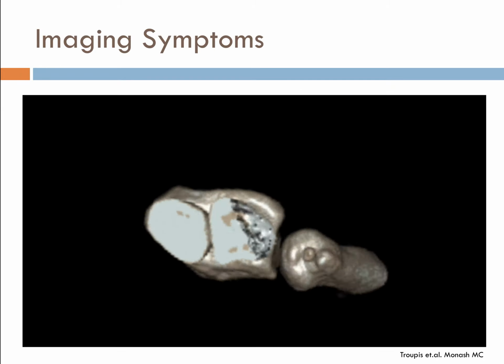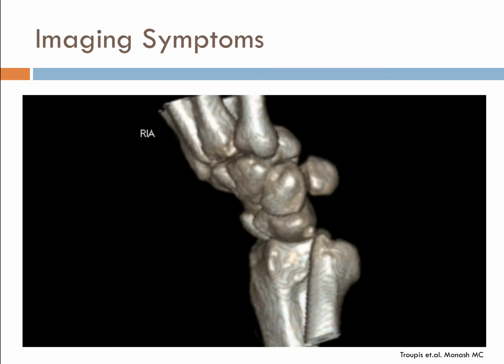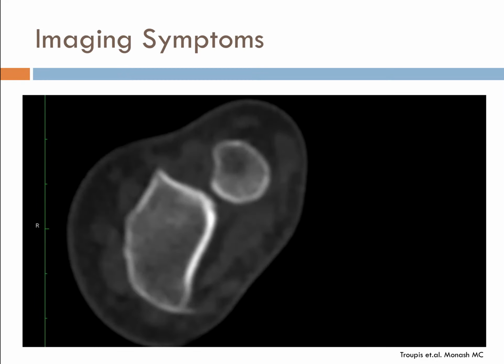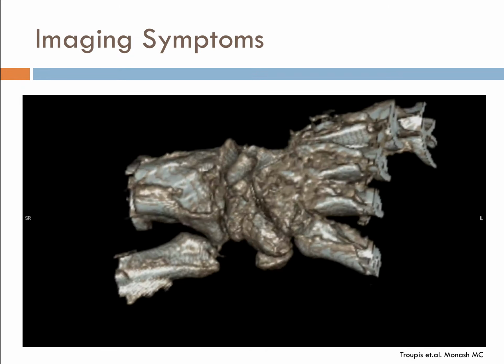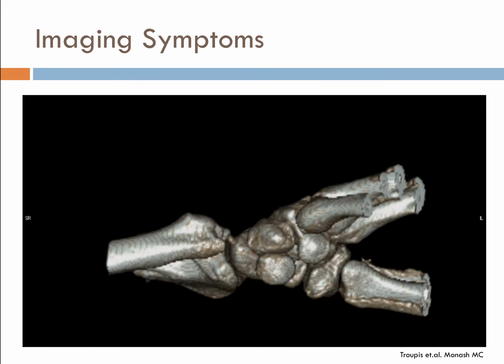Normally with CT, we look at images in static ways. The advances that are currently coming with CT technologies is that we can actually get the patient to do an action, to move. In this case, this patient, the radio-ulnar joint, move within the CT scanner and produce images that not only show the anatomical position, the anatomy of the patient, but also show the functionality in 4D, and that has been a very powerful force in CT technology.